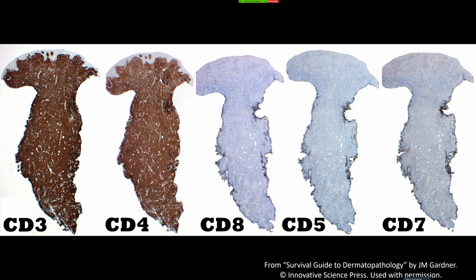Once you've got this big tumor, well, do I really need to do a PCR here? No. That's obviously, to me, just on these immunostains, clearly T cell lymphoma. As not a Hemepath expert, I don't see any way this could be anything else. So that's been the frustration in practice.